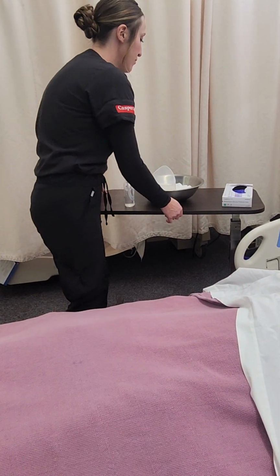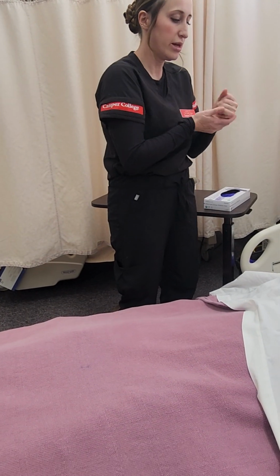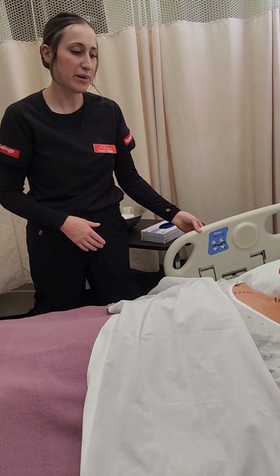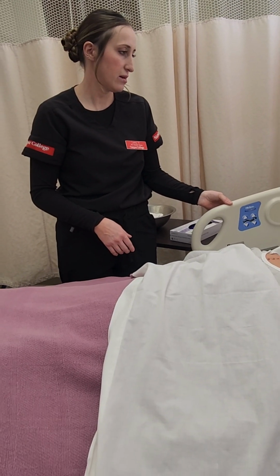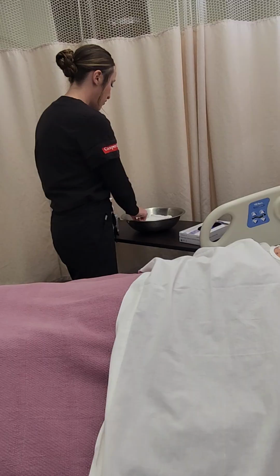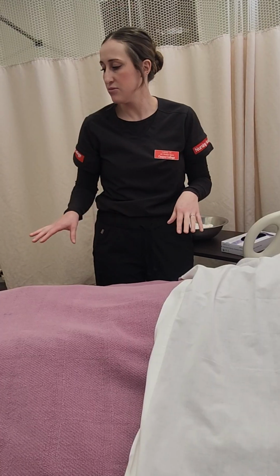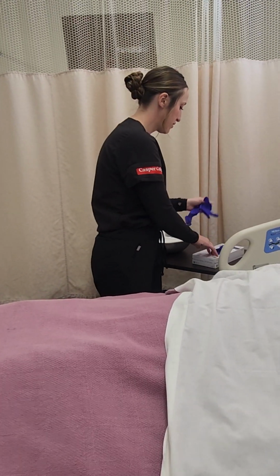Alright, so I am here because I'm going to be removing your urinary catheter. Have you been having any issues with it? No. Okay, have you noticed any abdominal pain, any burning, anything like that? Nope. Okay. Are you in any pain right now? I'm not. Okay. So before I can discontinue it, I'm going to first do a skin and GU assessment, empty your bag, and do some pericare. Okay. Is it going to be okay if I expose you? Yes. All right.